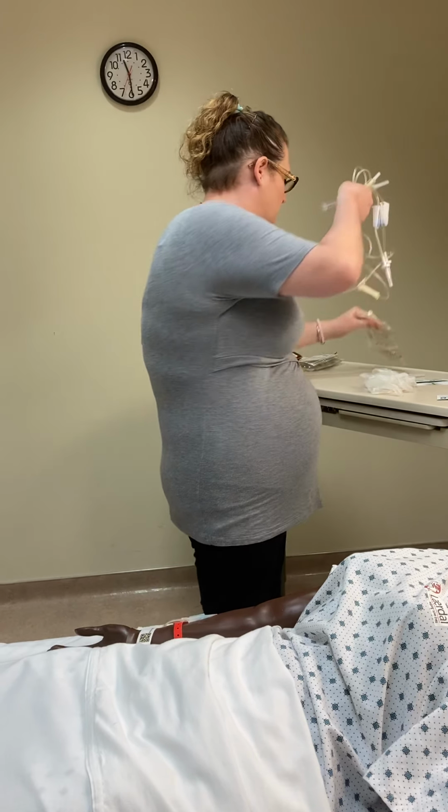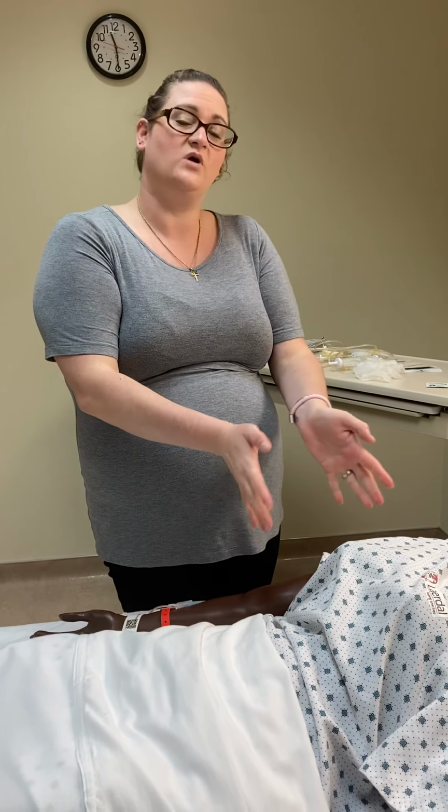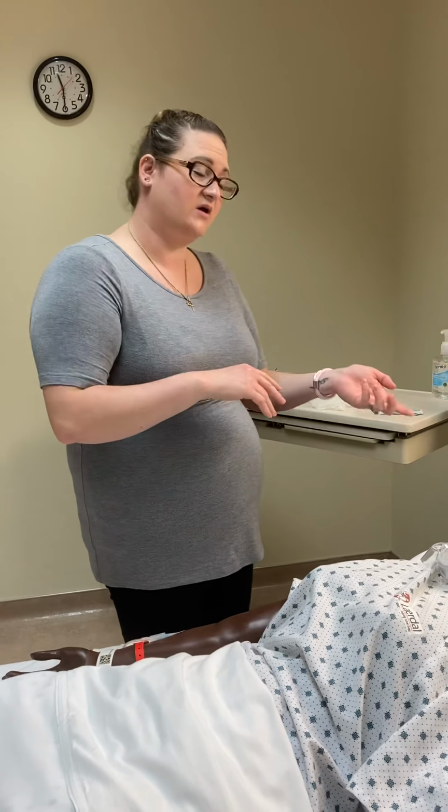So I'm gonna go in and introduce myself and let Ms. Mary Jean Johnson know that I am going to get ready to do the blood transfusion for her. She came in with a lower GI bleed. We'll say her hemoglobin is at a 6.8 and she's usually around a 9. They do want us to do 1 unit of packed red blood cells for her. And I'm just gonna get her IV going so that I can go and get the blood.